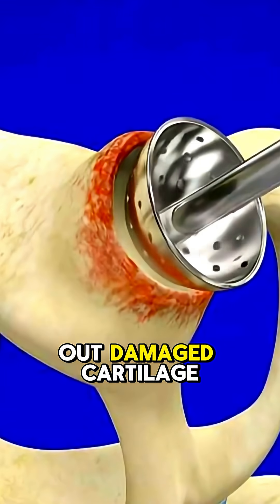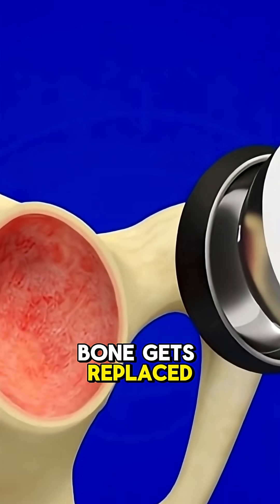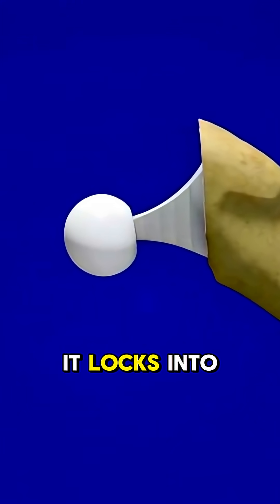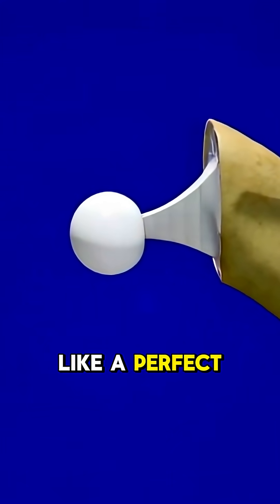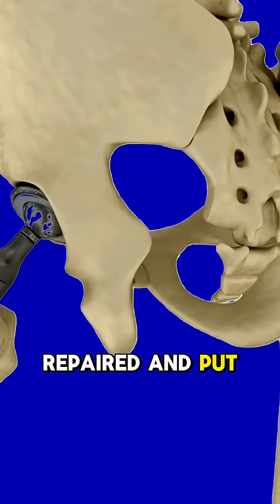The joint is cleaned out, damaged cartilage gone. Then the top of the thigh bone gets replaced with a smooth implant shaped like a ball. It locks into a new socket like a perfect puzzle piece, and the muscles and tendons are repaired and put right back.